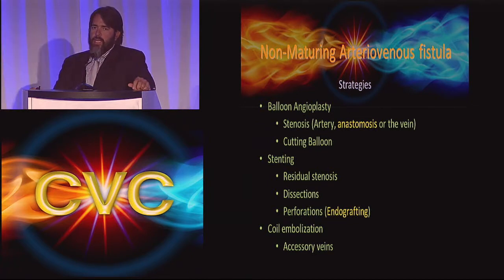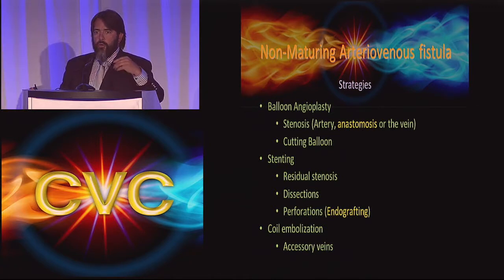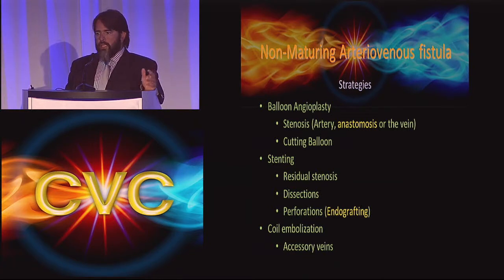And occasionally I'll use an endograft if there's a perforation. Most of the perforations you can actually control with just leaving the balloon up for a minute or two. So, if you see a little bit of extravasation, don't go crazy on it. If you have actually opened the outflow properly, most of these extravasations will just heal on their own. There is nothing that needs to be done.